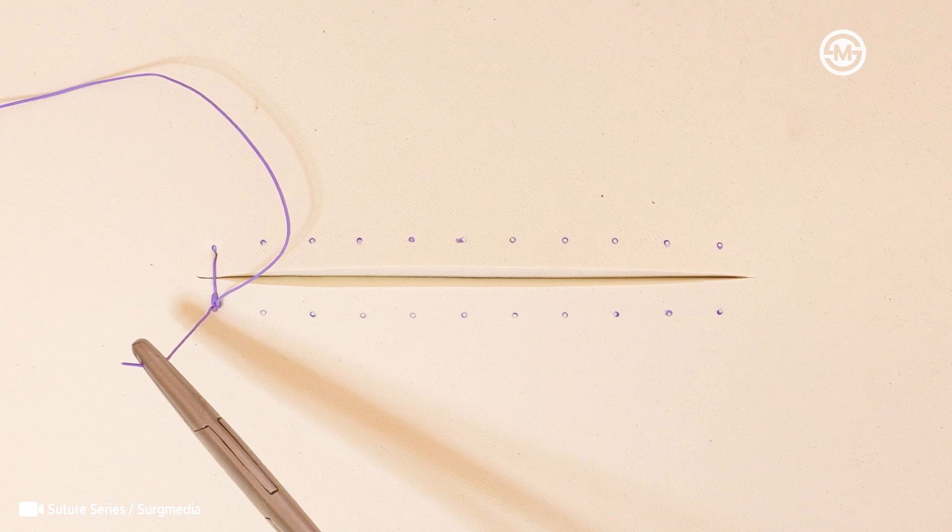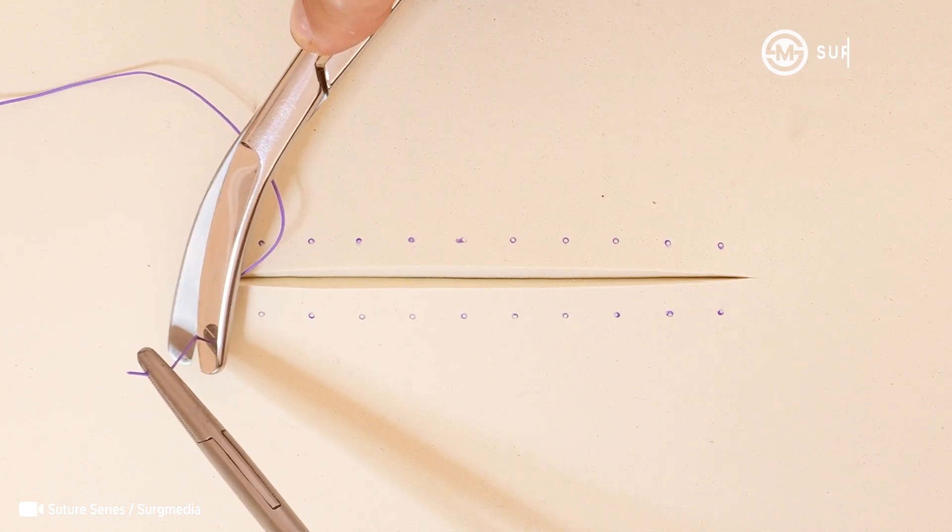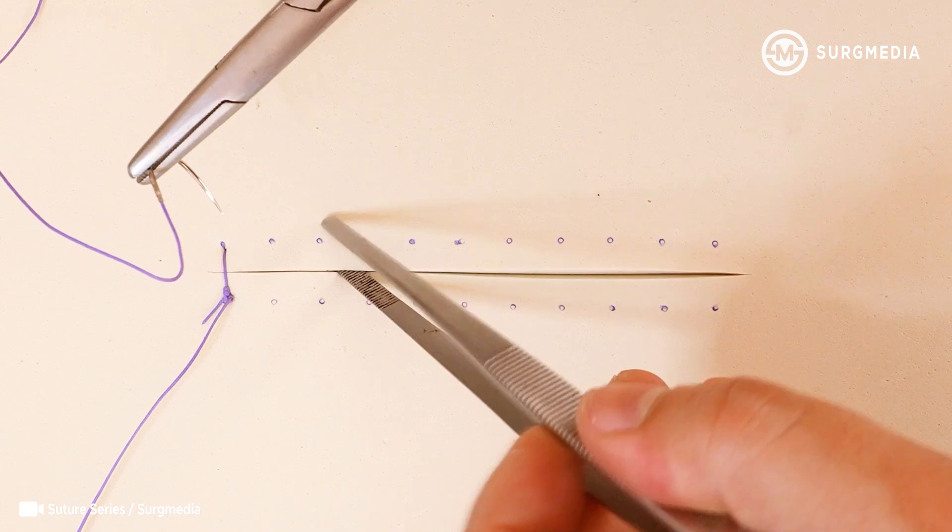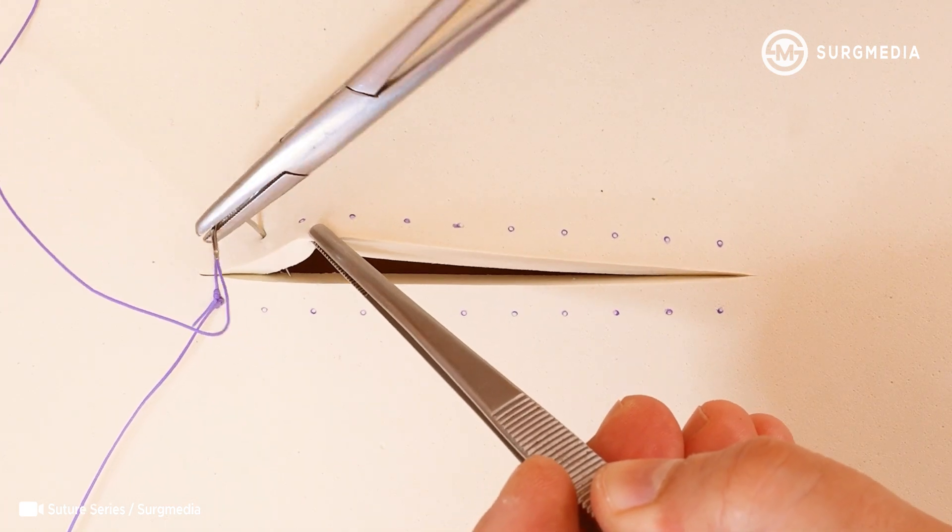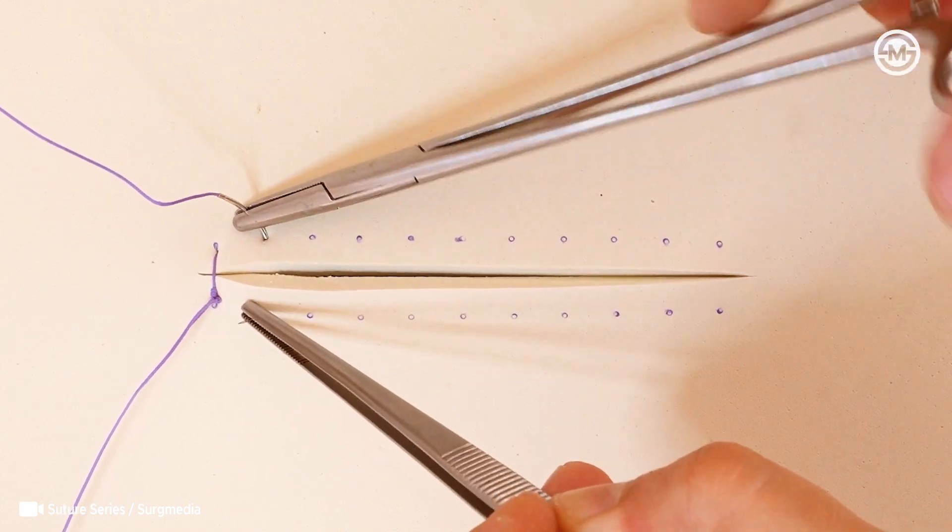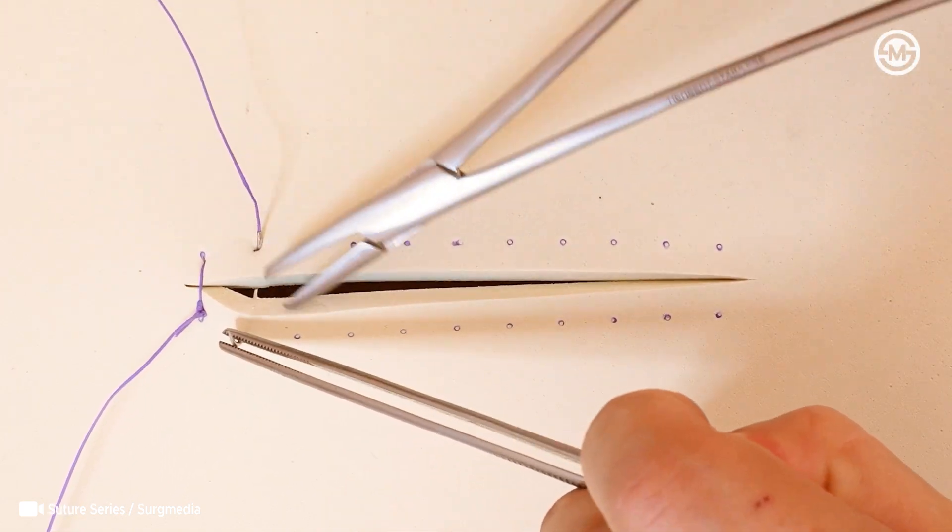So, how does it work? It's actually very similar to the simple interrupted suture, except here we're not stopping to tie a knot after every stitch. Instead, once the first stitch is placed, the suture continues in one smooth running line all the way to the end.